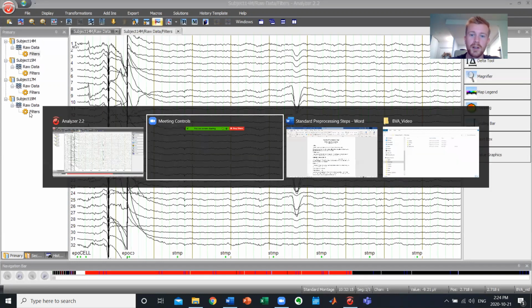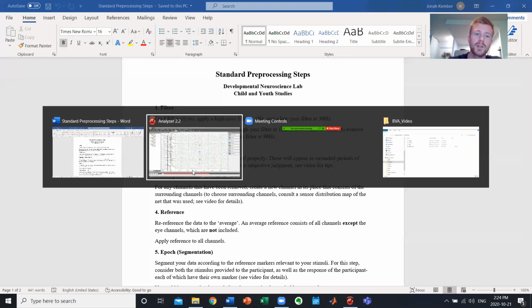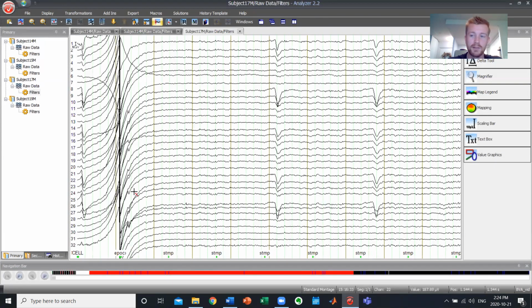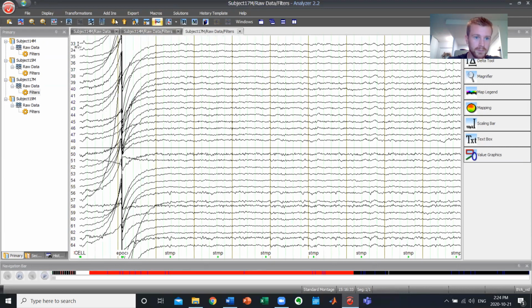So after filtering, we're going to be editing channels. The point of editing channels is to remove any channels that didn't record properly, weren't recording at all, or something is just really off with them where it's kind of comically bad. So we'll take a look at these ones right here.